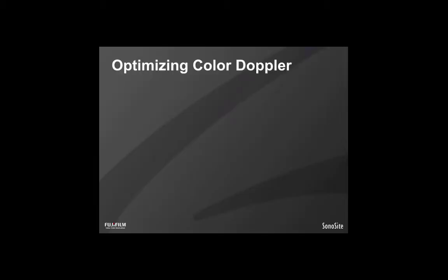Now, in order to avoid aliasing and maintain the integrity of your color information as best as possible, there are a few steps you can take to optimize things. One of the most basic things that we see is that people use a color box that is far too large for what they actually need. If you choose a color box that covers only the structure of interest, for instance, a valve and its receiving chamber, that's the right size for the color box. So use the smallest one you need, and you'll have better quality information.